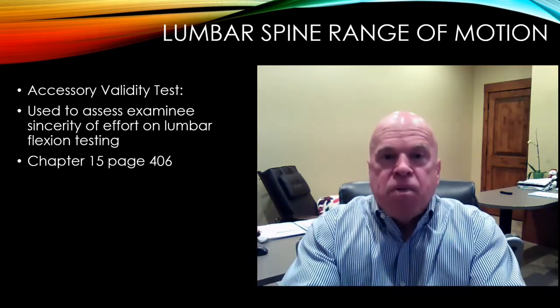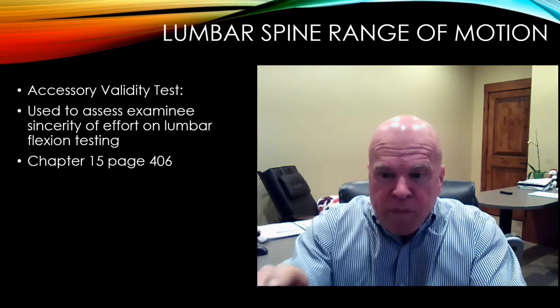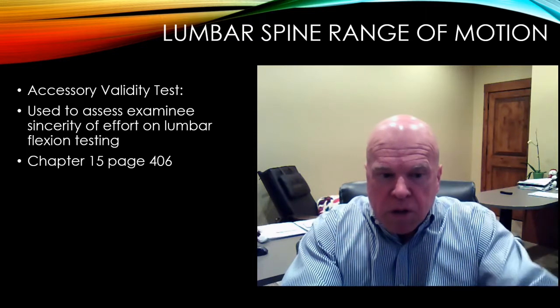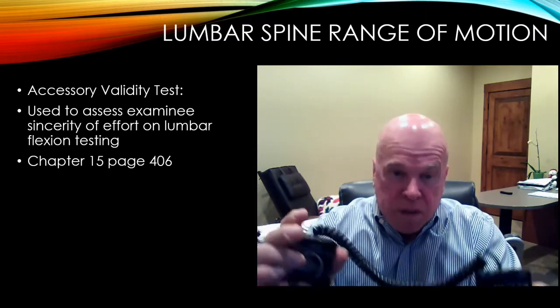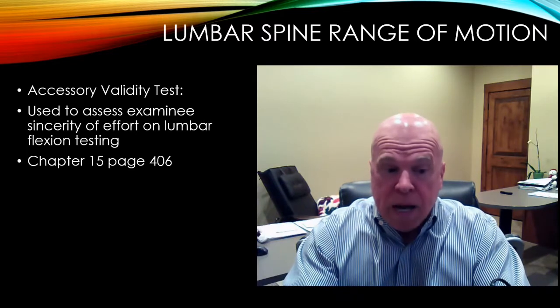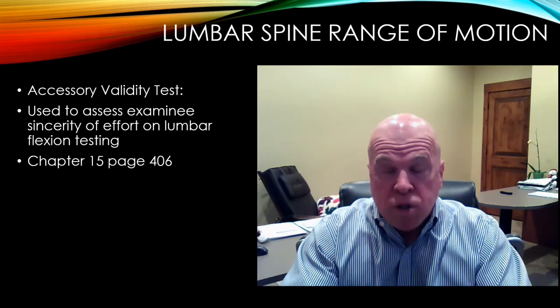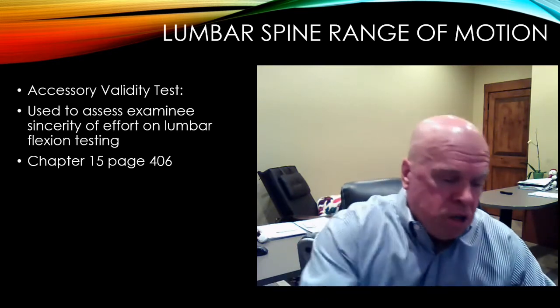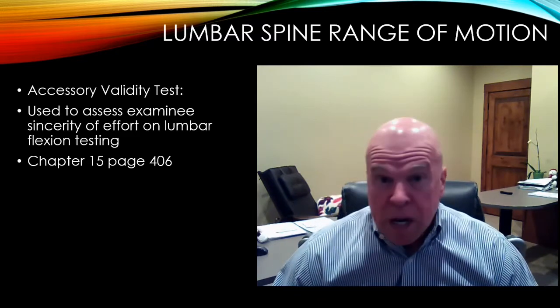So with this type of inclinometer system, each movement at each one of the inclinometers creates a recording on the display of the master goniometer, the master inclinometer. And you don't have to do that yourself, which dramatically reduces the workload involved in obtaining range of motion measurements.